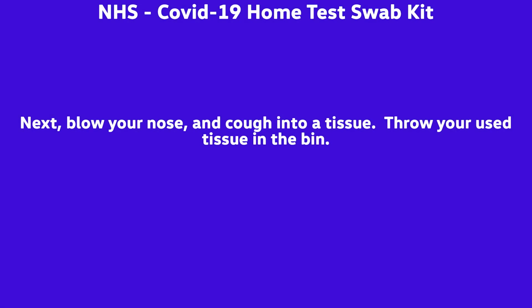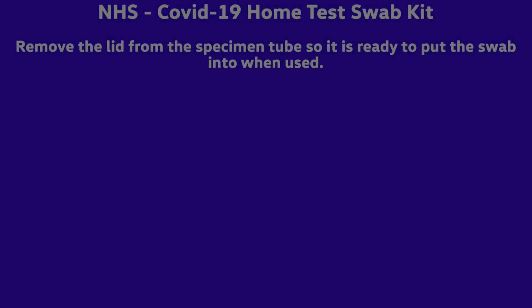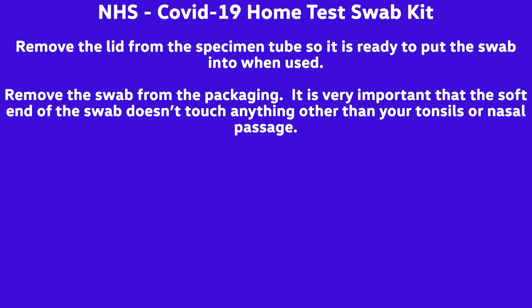Next, blow your nose and cough into a tissue. Throw this tissue away in a bin and wash your hands again thoroughly using soap and warm water. Remove the lid from the specimen tube so it is ready to put the swab into once used. Remove the swab from the packaging.